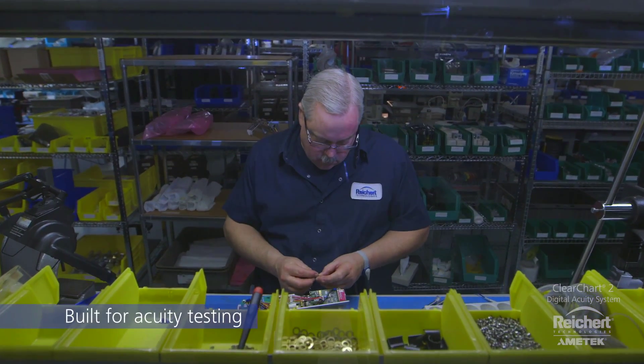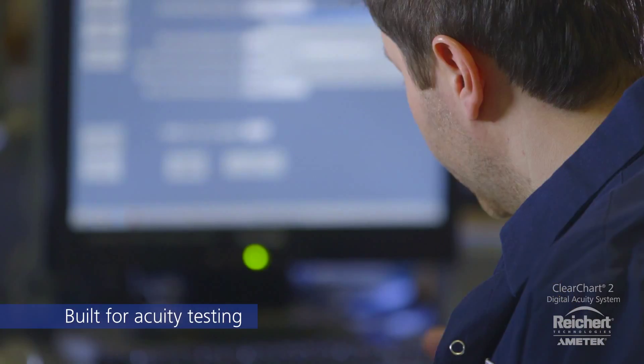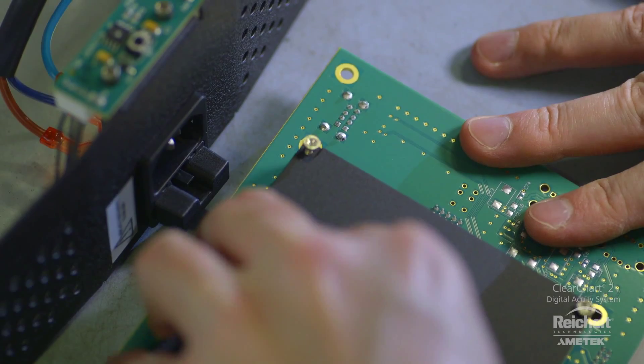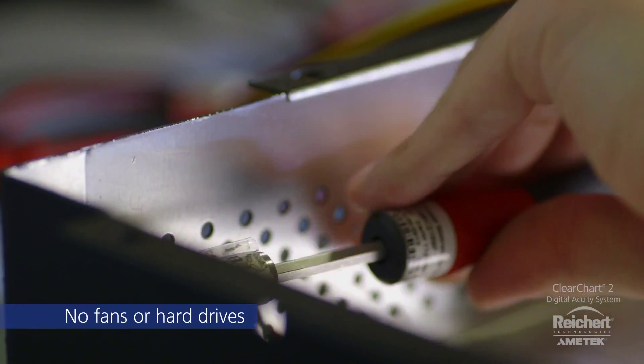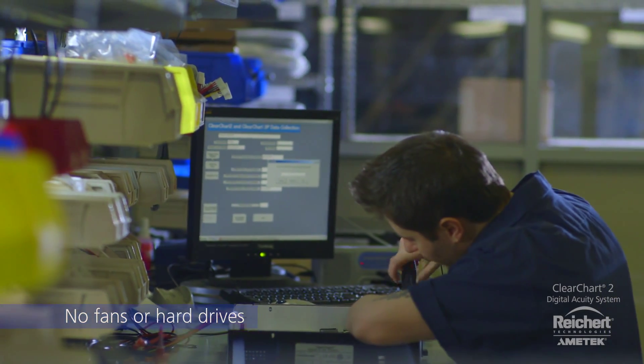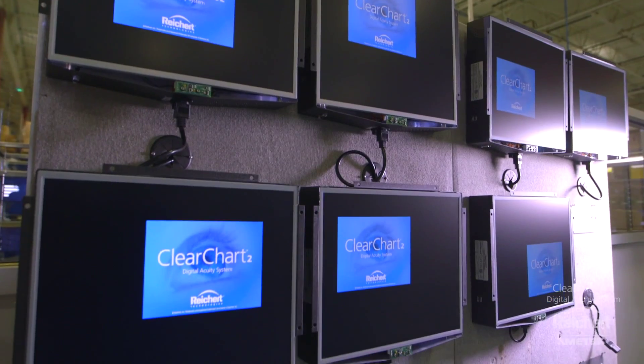ClearChart 2 is custom designed by Rikert using the robust and stable Linux operating system, ensuring consistent and reliable performance over Windows-based systems. Requiring no separate components or software, ClearChart 2 is free of moving parts, noisy fans, and spinning hard drives, providing cool running, silent, and dependable operation.